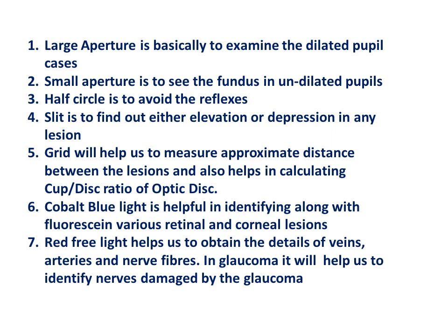Slit is to find out either the elevation or the depression in any lesion which you find in the posterior segment. Grid will help us to measure approximate distance between the lesions and also helps in calculating cup disc ratio of the optic disc. Cobalt blue light is helpful in identifying, of course, along with the fluorescein dye, various retinal and corneal lesions.